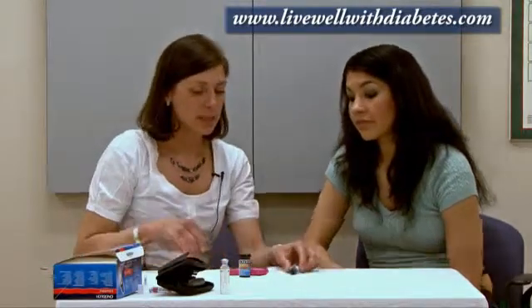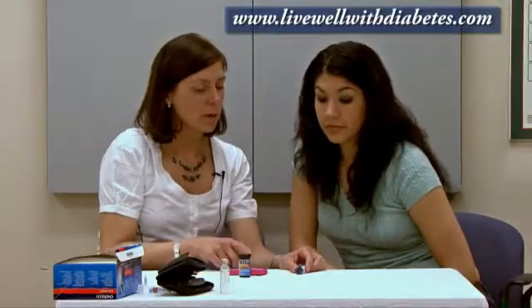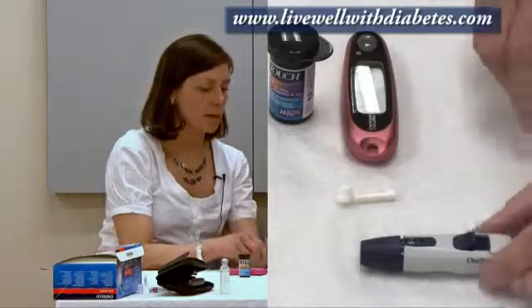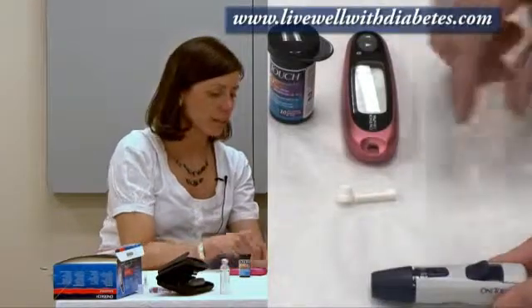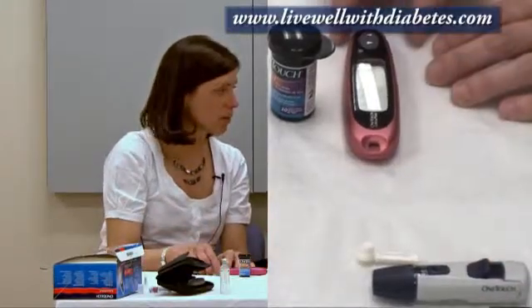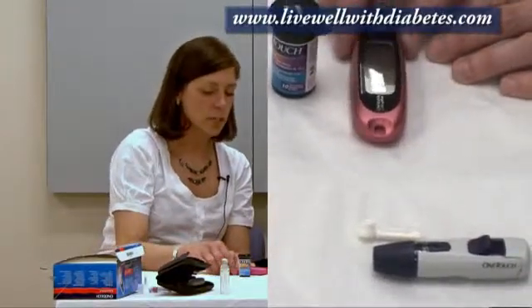How do I test my blood sugar levels? There are many different machines on the market, and this is just one kind. For this particular one, there are two parts to learn: how to get a blood sample from your finger using the lancet device, and how to use the machine itself. Each machine uses a particular test strip, and you have to get the right kind of test strip that matches the machine you're using.